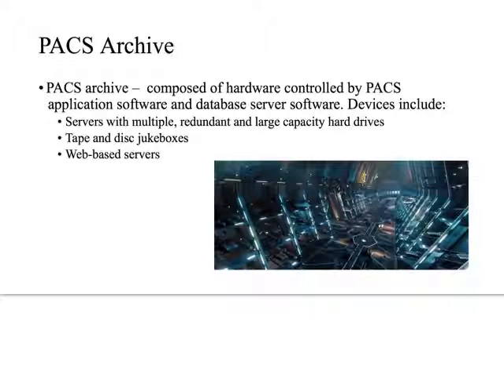So this archive is huge, and this is really going to be the major limiting point of PACS, because this is the hardware that actually controls the PACS application software, as well as the databases. And so these are going to be things like servers, multiple servers, redundant arrays, tape drives and jukeboxes, as well as some web-based servers.